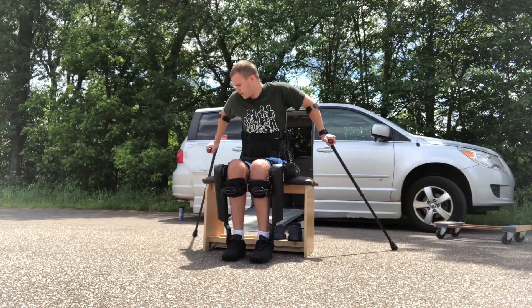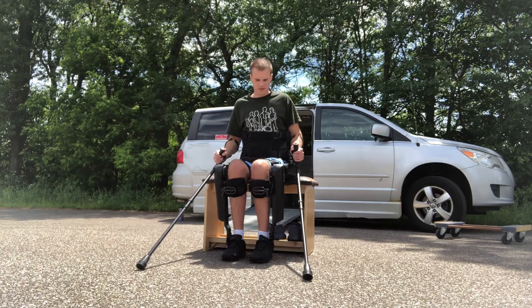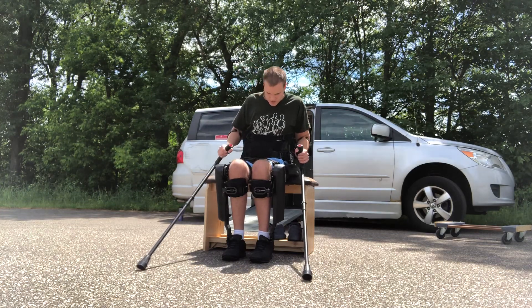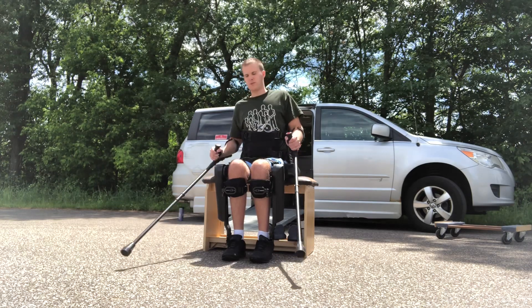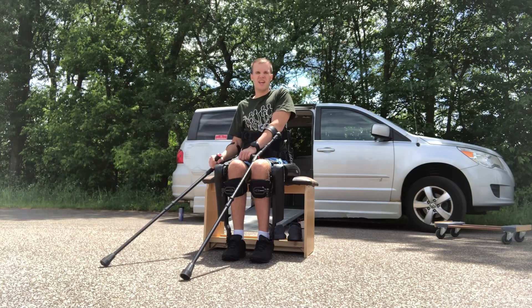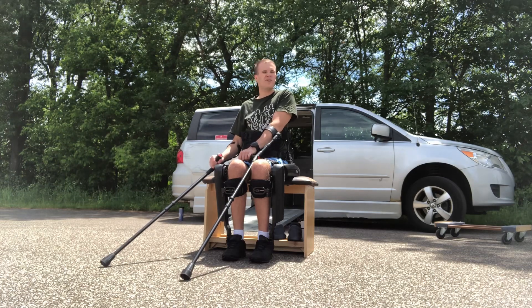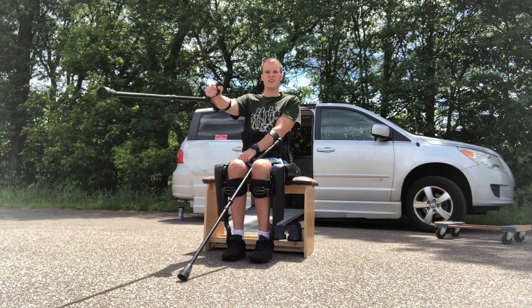I always put my crutches behind me so I can get a good feel for where I need to place them. Double-checking that my straps are strapped. I have my dad standing in front of me so that when I stand, if for whatever reason I were to fall or anything, he could grab me — he's literally right here.